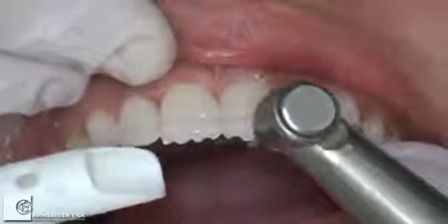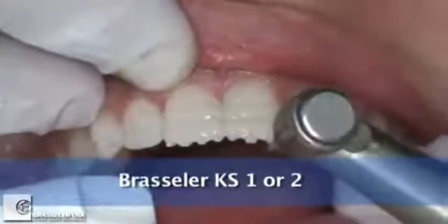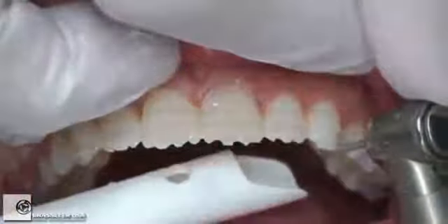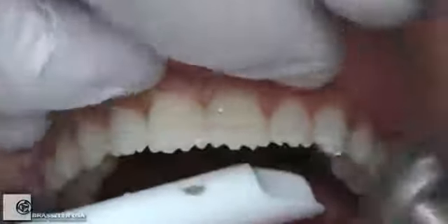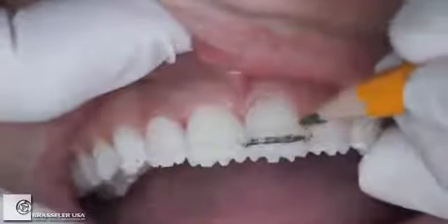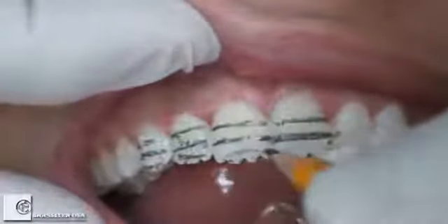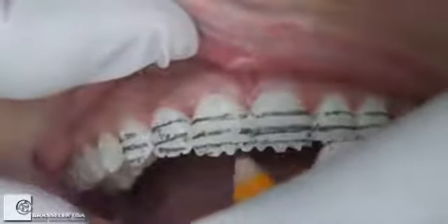Then I'll use something like an LVS4, LVS3, could use a KS1 to do a depth cut, about a millimeter 0.4 in the incisal edge. Typically I can work with about 1.5 millimeters thickness at the incisal edge to create the effects I want. So I'm going along and actually using, I believe, a KS1 here, which is 1.2 millimeters, and doing a depth cut just a little bit thicker than the thickness of the burr. Then I'll use a pencil or some sort of marking device to mark the depths of those depth cuts. And then we're going to come back and remove all the material between those depth cuts.